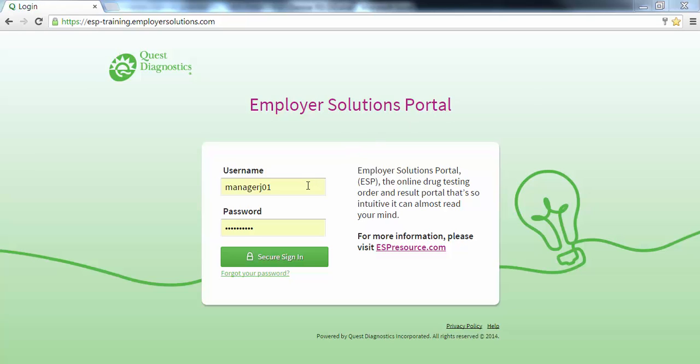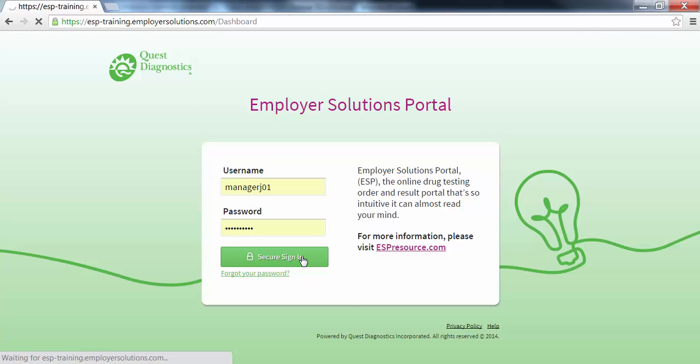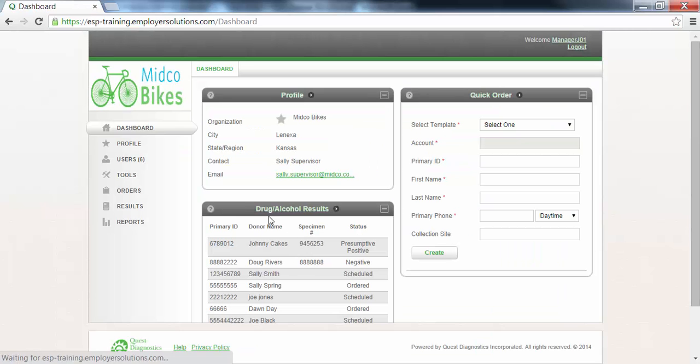At the login page enter your username and password and click the secure sign-in button. After successful login you will see the dashboard for your organization.